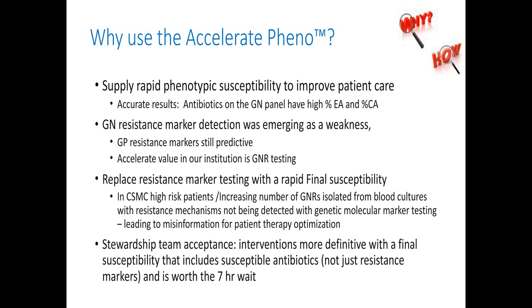Thank you. Our next question is, please explain how the monomicrobial call provides clinicians with the confidence to de-escalate antimicrobial therapy. What is the significance of this?